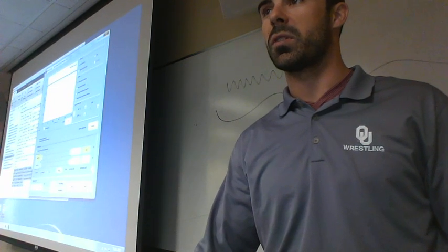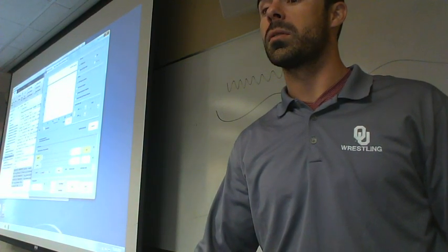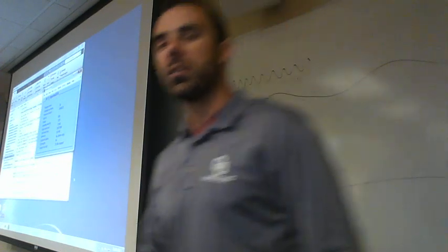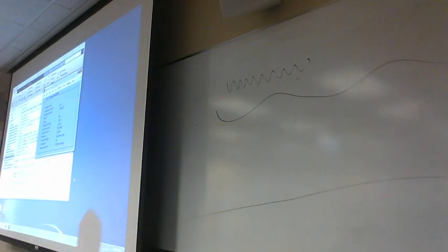Yes, sir. I accidentally exited my GUI. Okay, so bring up the GUI again and I'll show you how to do that. This will take a moment or two to work because it needs to think.